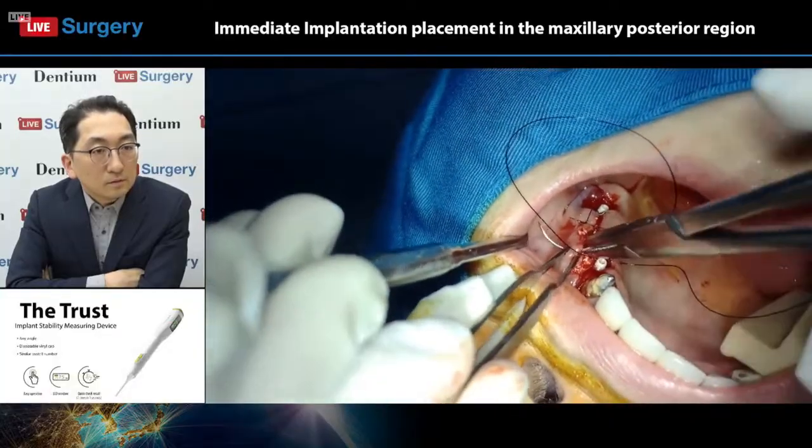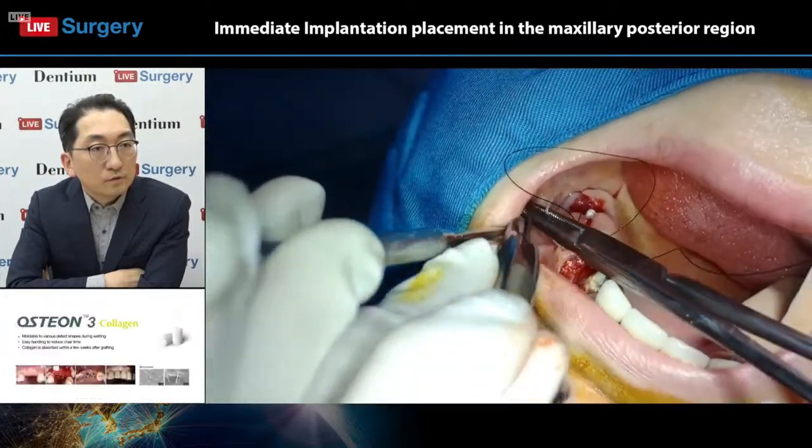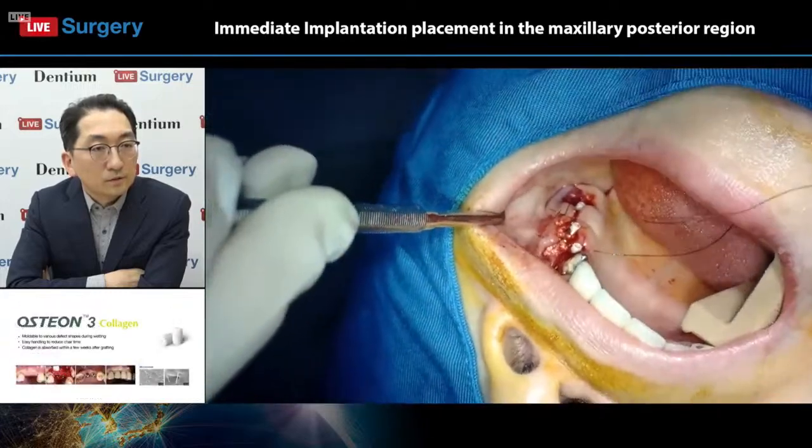Okay, now I made a suture between the 24 and 25 implants.